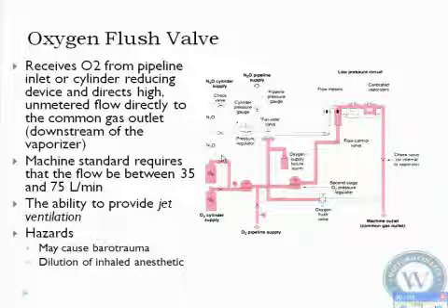So if you did this repetitively, you're going to drop your anesthesia levels. Okay? You're going to dilute them to a point where you'll see clinically that it will drop on your monitor, and you're going to see your inspired level drop of whatever your volatile agent is. Once your volatile agent drops, you can get awareness. Okay, so awareness can occur if you're using your flush valve frequently. We shouldn't ever have to use our flush valve frequently.